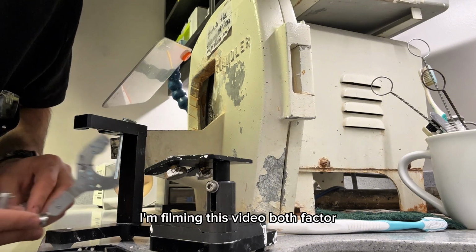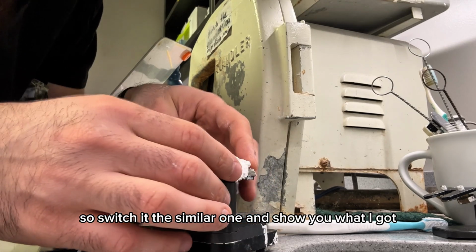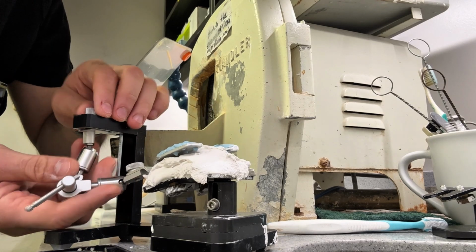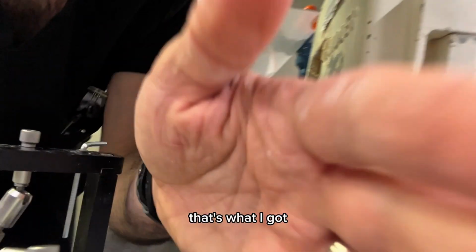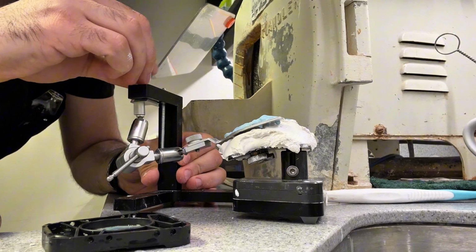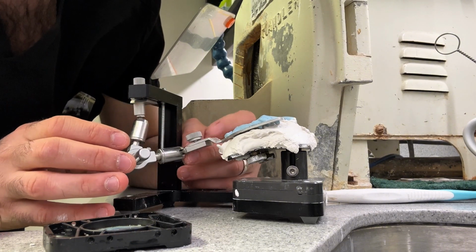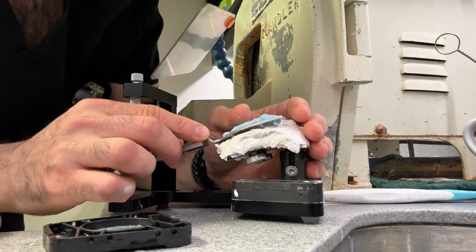I'm filming this video post factum, so that means I already did it. So I'm gonna switch it to a similar one and show you what I got. So that's what I got. After it is set, solidified, you unscrew it, loosen it up. This one, and also this one. This way you can retrieve it.